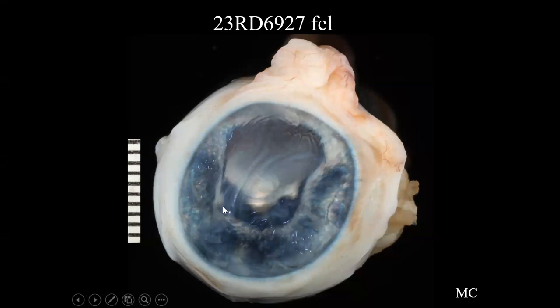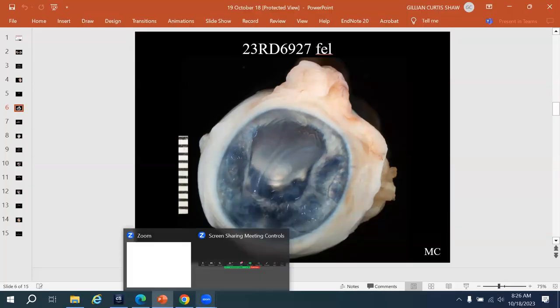This front image of the eye, while it is whole, reveals potentially some degree of dyscoria. I will support that there probably was dyscoria in vivo as well, and not just fixation artifact. Basically, the iris leaflet up here looks a little shorter and a little bit longer ventrally. And then underneath the ventral iris leaflet, peeking out at the edge of the pupillary margin, there are these ruffly looking brown bumps, which are the uveal cysts, as it turns out. Again, I'll support that in a second histologically. You may also note that the cat's iris in this case is blue, which has nothing to do with this, but there you are.